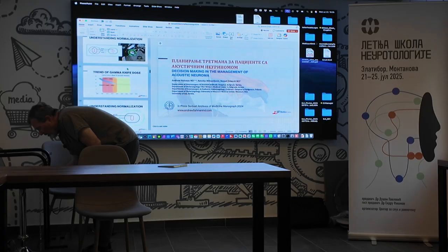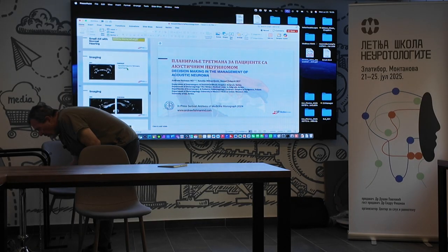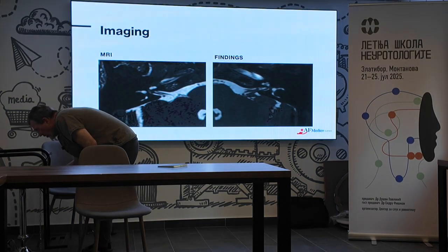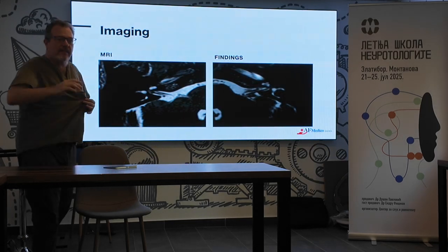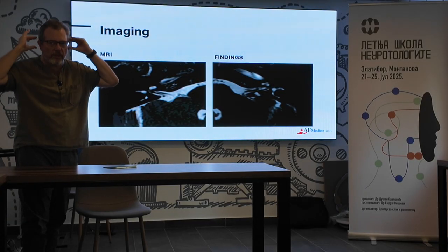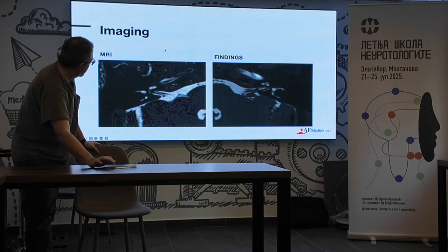Depending on the manufacturer, one is Siemens and one is GE. So here it is. So this is CISS or Fiesta, okay? They're both sub-millimeter T2, and it's the same study that's used for looking at a small acoustic neuroma. You just need it through the skull base, and this is extremely high resolution.